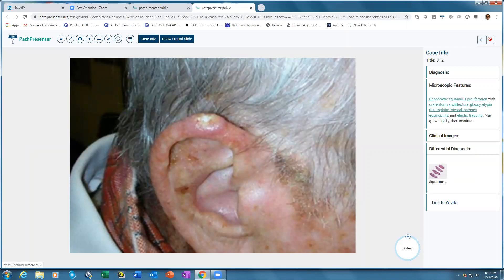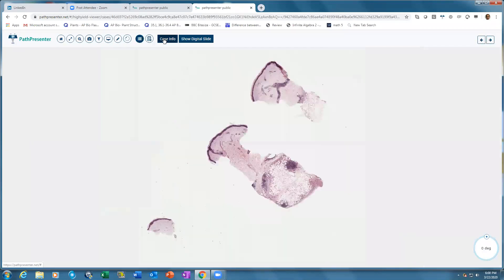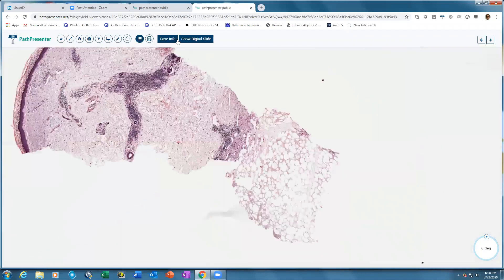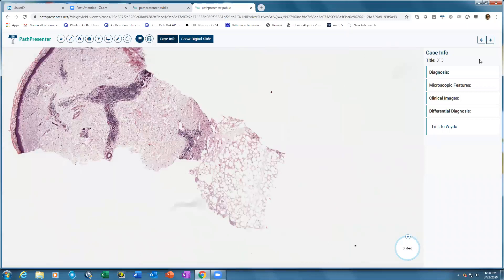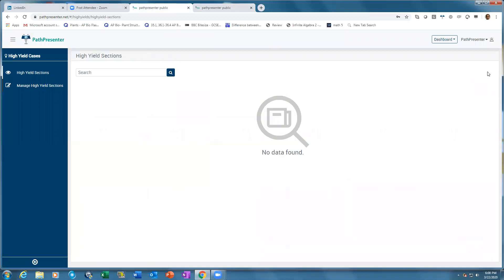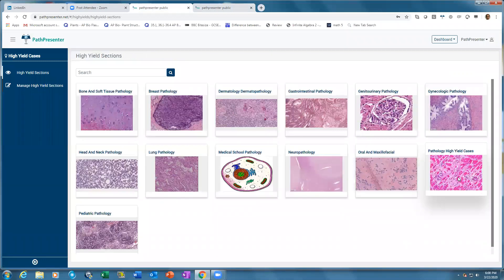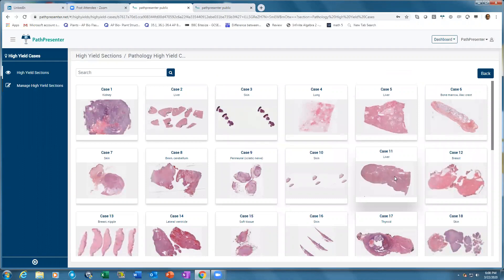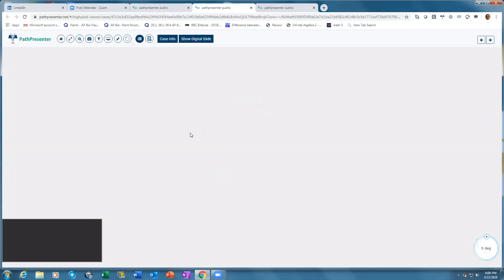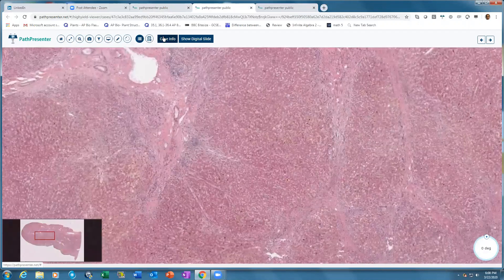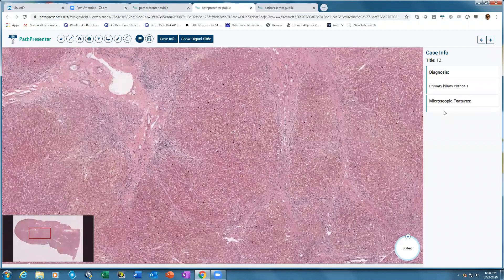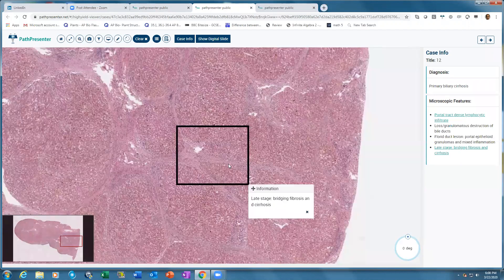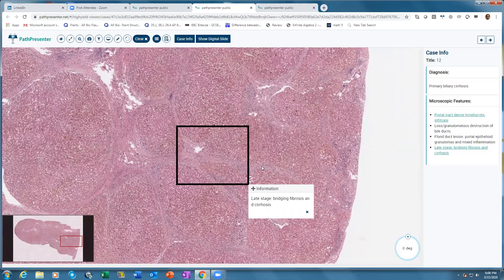To move to the next case, just click here and it will move to the next case. You can click the Case Info button off, look at the slide again on your own, then click Case Info again and it will give you all the features. This is available for all specialties. The pathology high yield cases are handpicked from the Osler course, and for each case you can look at the slide first without any information, then click Case Info to get the diagnosis and annotated microscopic features. Go ahead and use this resource for self-education and group learning — hopefully it will help you prepare for the board exams coming up. Best of luck.